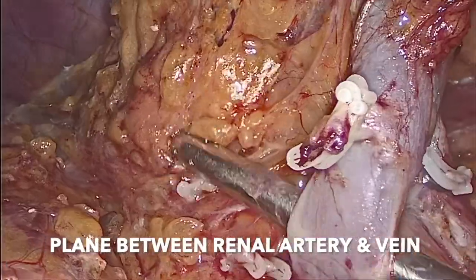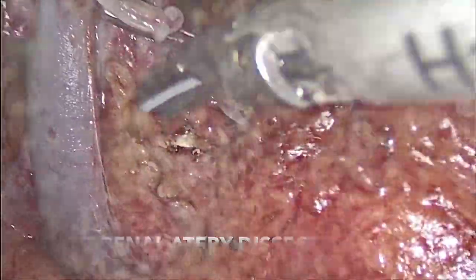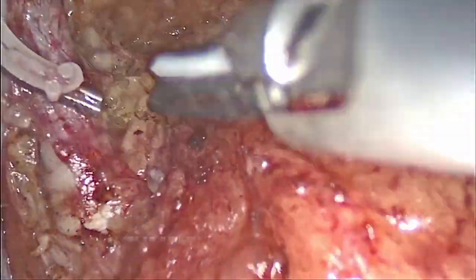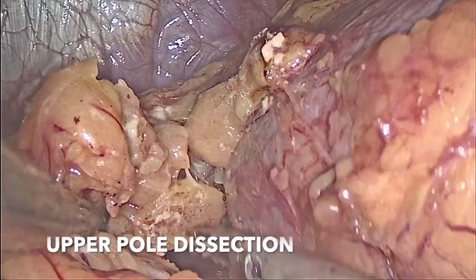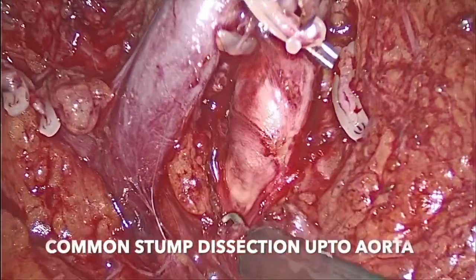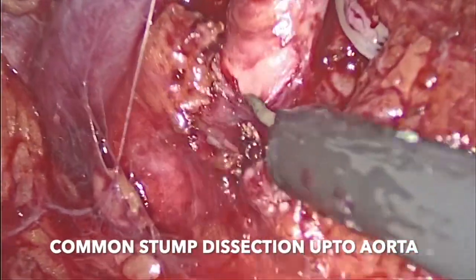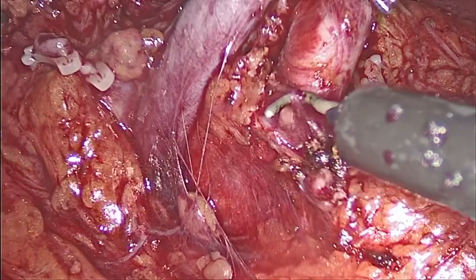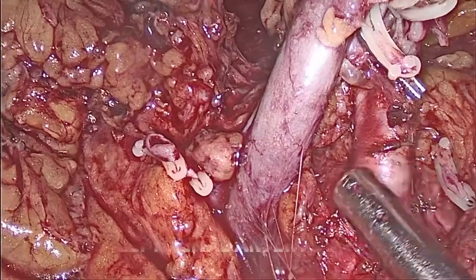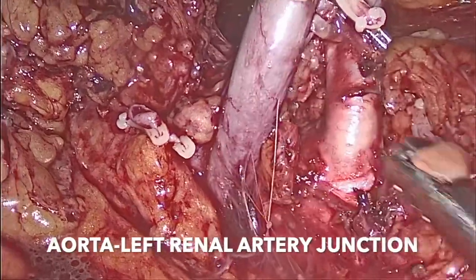Hilar dissection being done and the plane between the renal artery and the vein is achieved. Renal artery is being dissected and skeletonized. Periaortic tissues being dissected up to the origin of the renal artery to achieve additional common stump length. Here we can see the origin of the renal artery from the aorta and its early branching pattern distally.